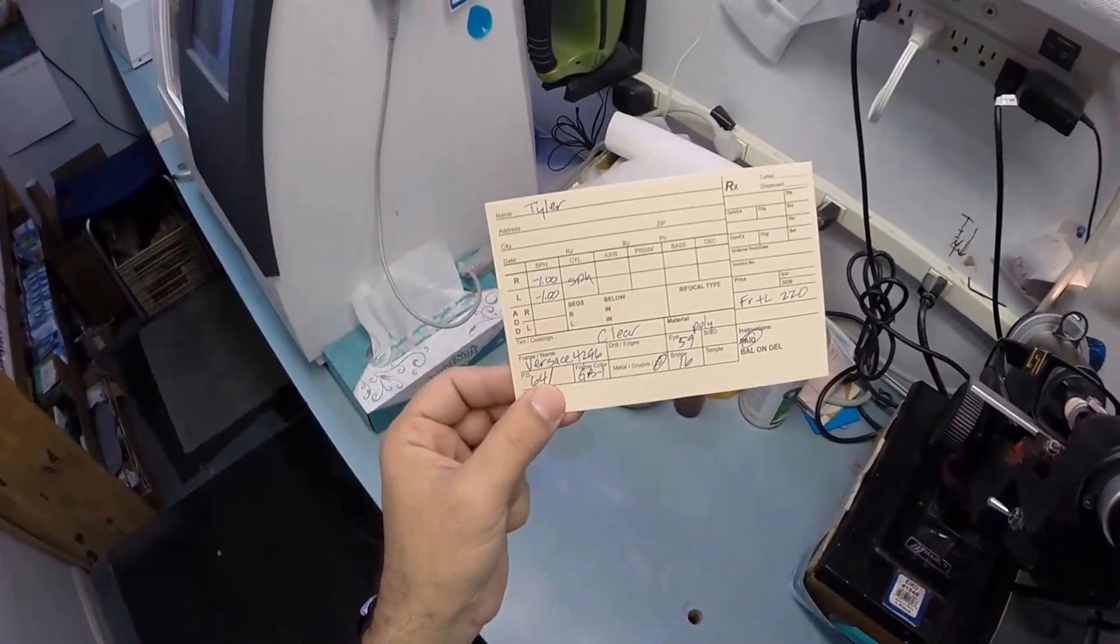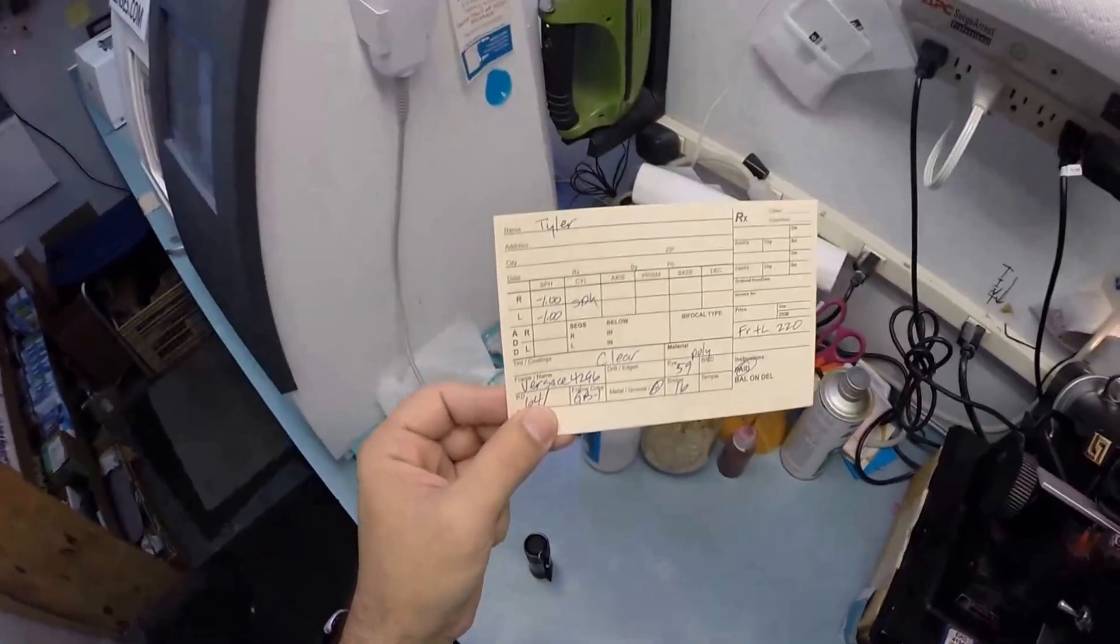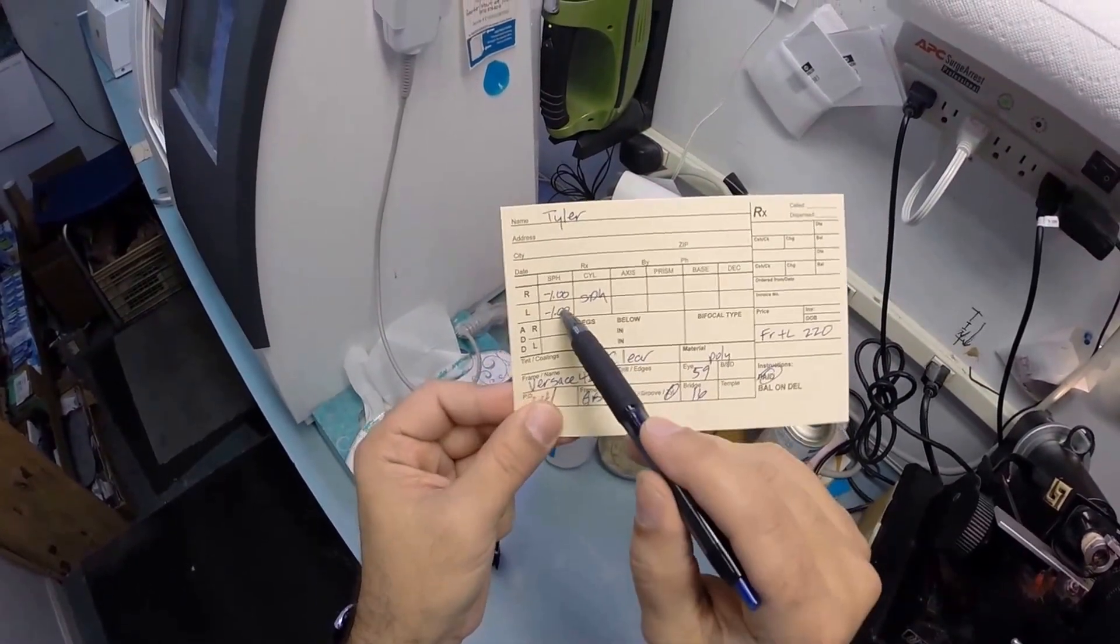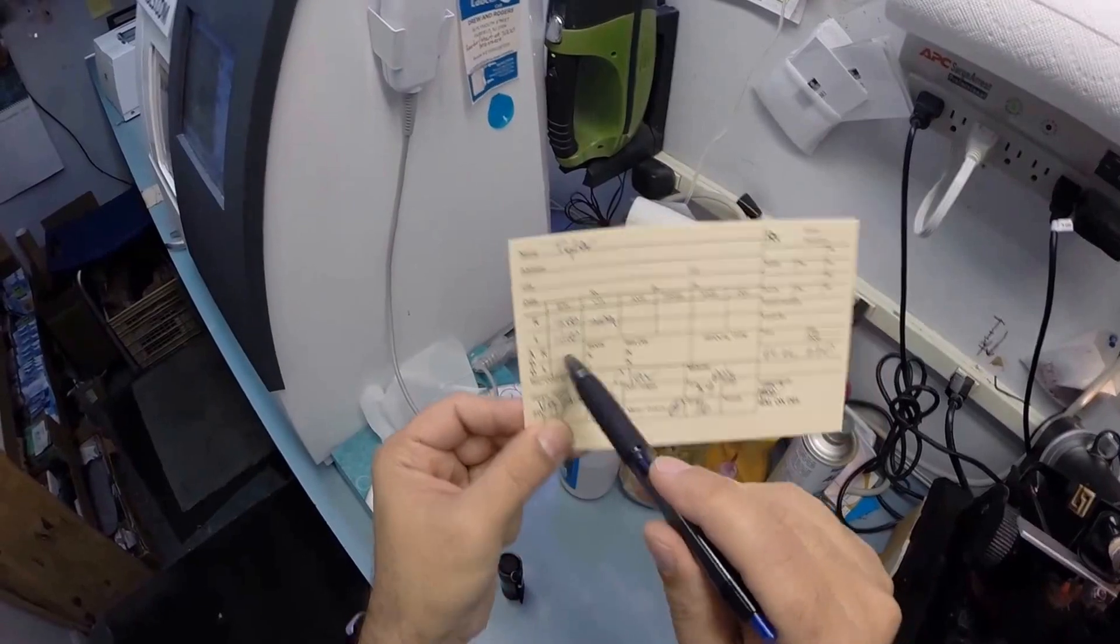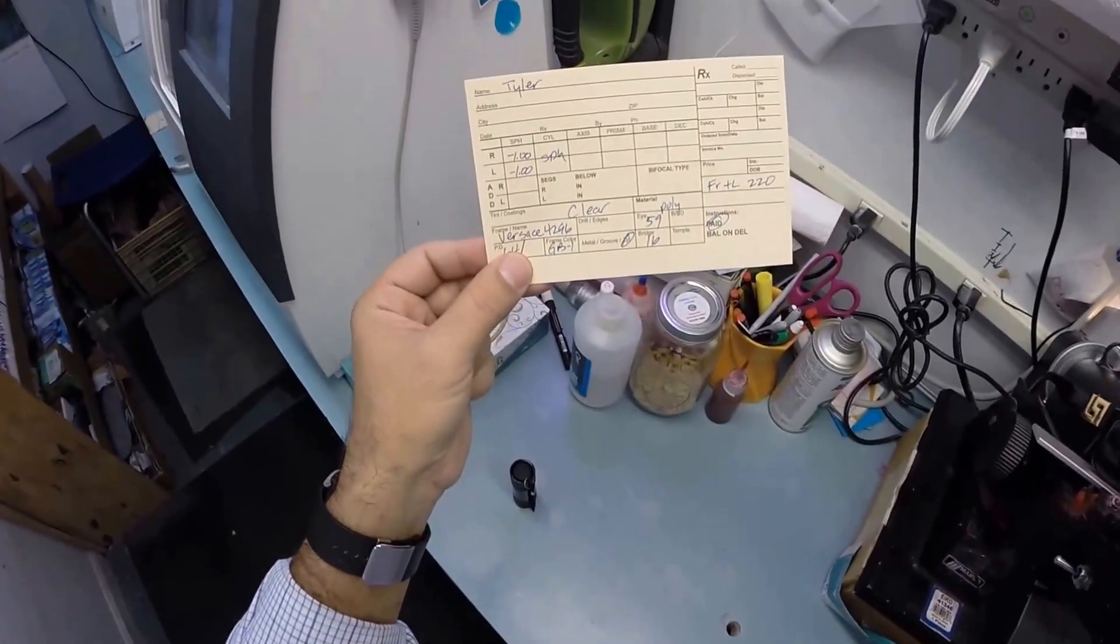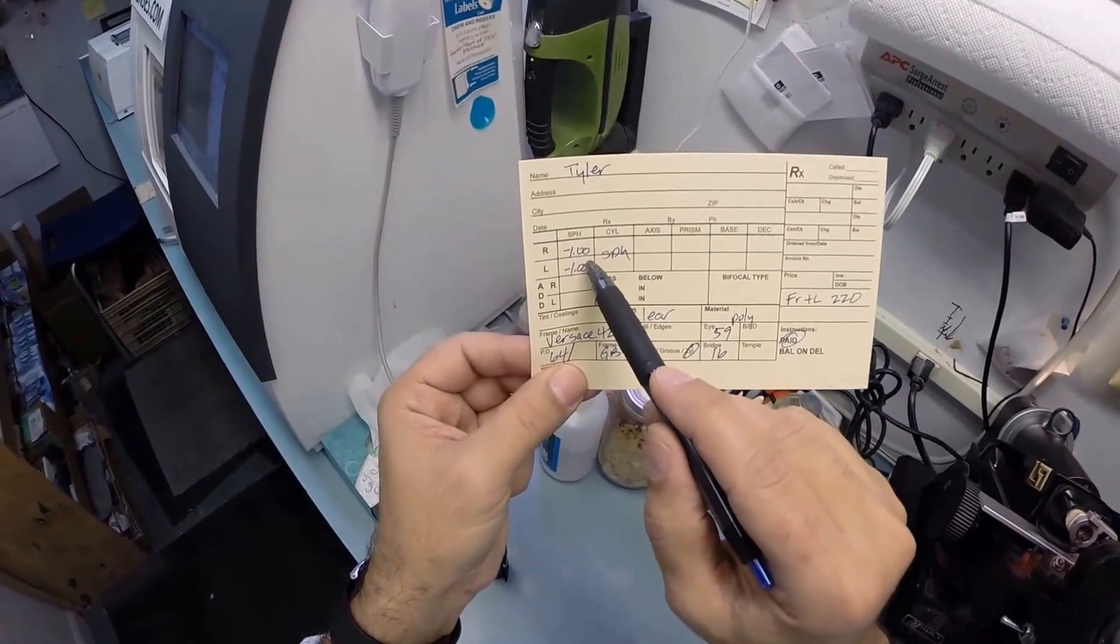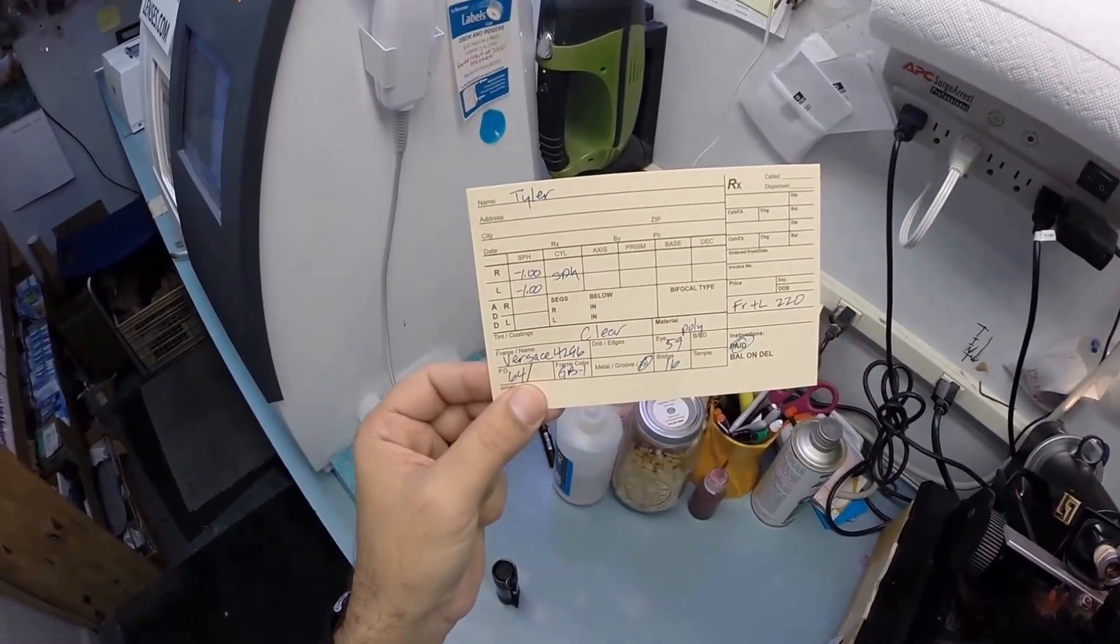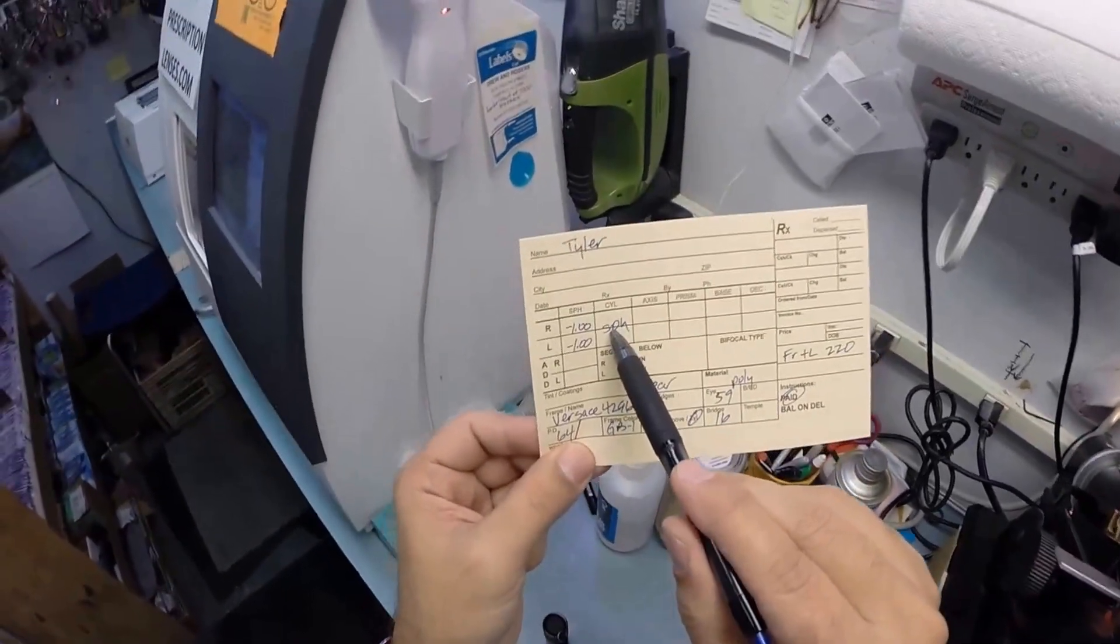It starts at zero, which we call Plano—other people in Texas call it a city. But it goes up in quarter increments: 0.25, 0.50, 0.75, 1. You need four steps of minification. You are nearsighted. Without your glasses on, everything is much too large. When you put these on, this will minify—hence the minus term—down to the correct size.